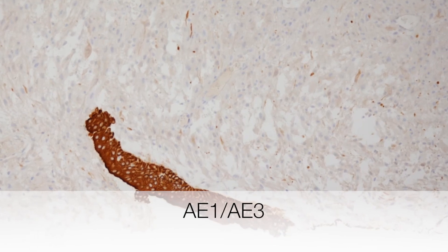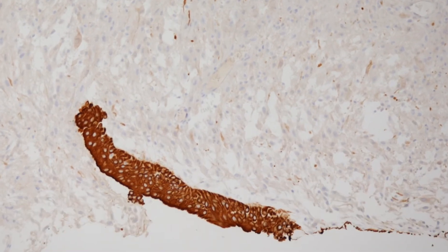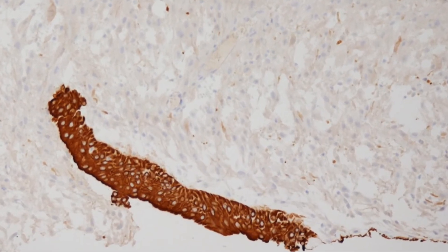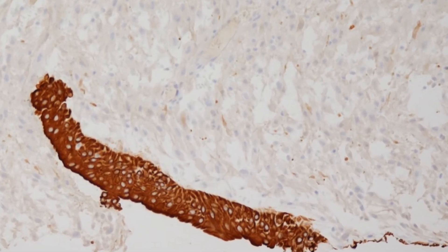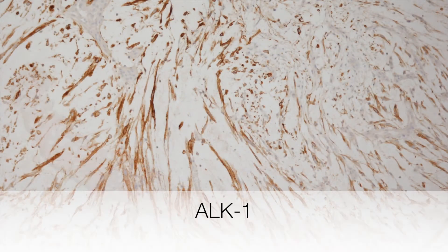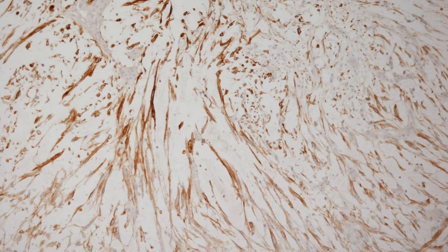This is the AE1/AE3 stain. You can see that the urothelium is positive. And here is the stain that gives away the diagnosis — it is the ALK1.